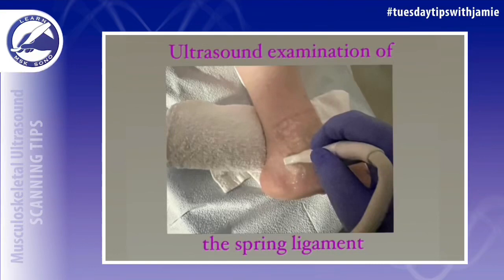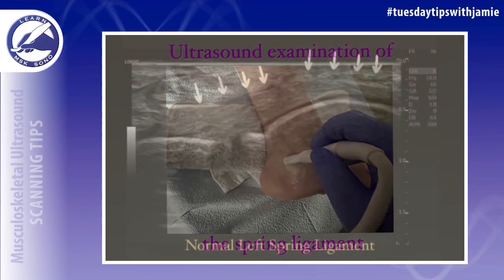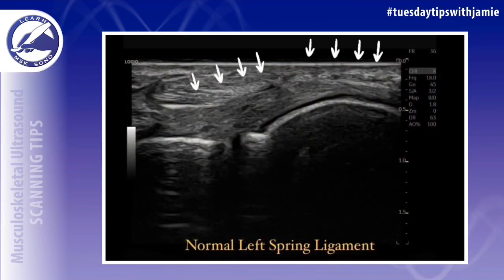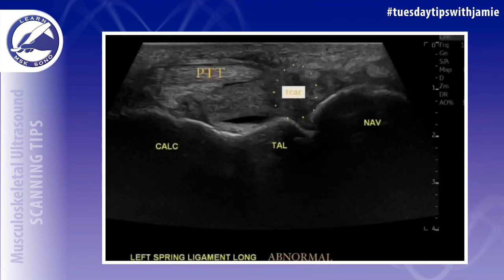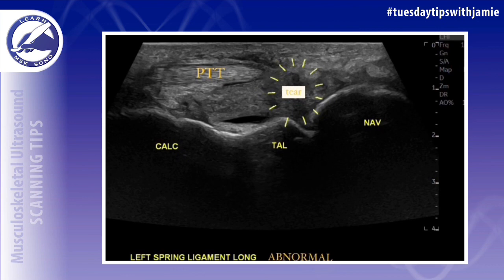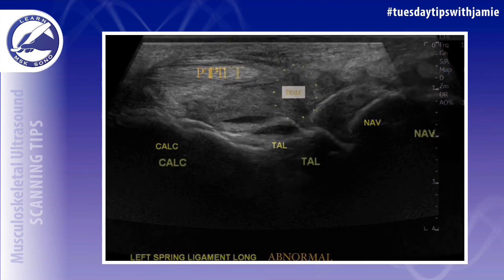Hello, this video is to show you how to locate the spring ligament of the ankle on ultrasound. The spring ligament can be seen on the medial side of the ankle as it passes over the talar head between the calcaneus and the navicular bones.